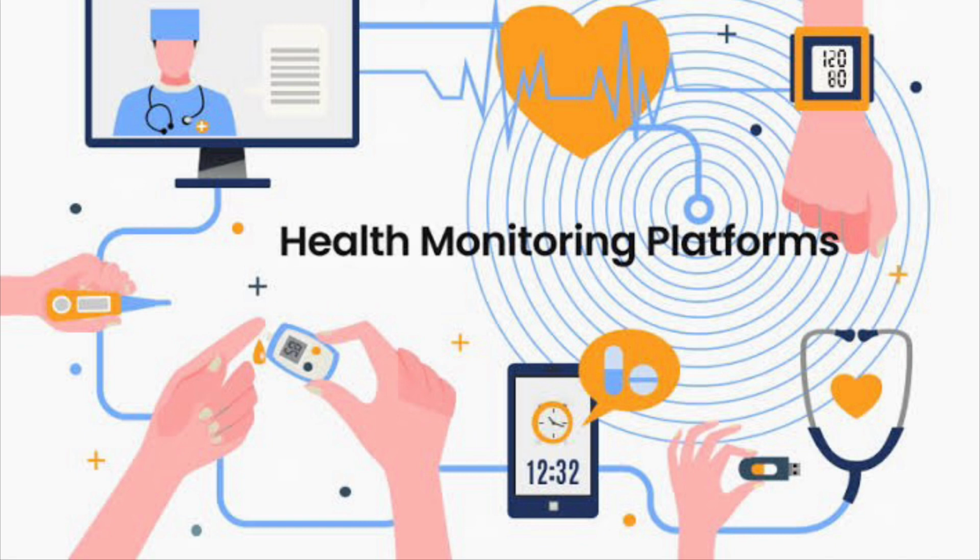And the fourth is provider satisfaction. That means the people who are involved in implementing this, especially the doctors, the nurses and the hospital, feel that this is definitely an exercise which is worth it, and it is providing satisfaction and improves the patient care. Now the third step is to identify a wearable device company or manufacturer. This will take some time because this technology is evolving day by day.